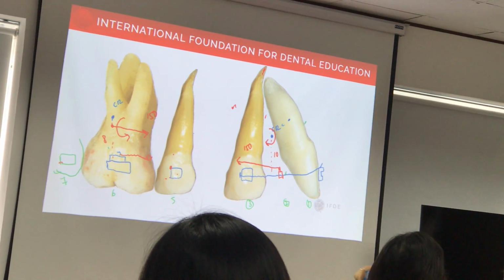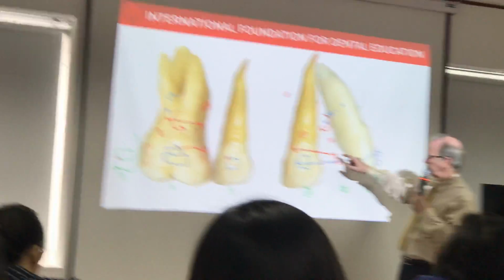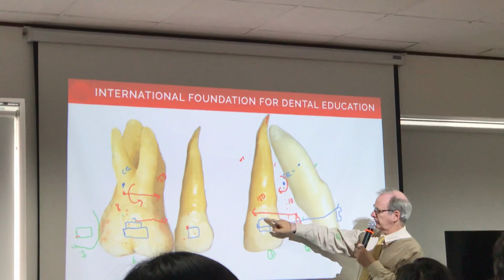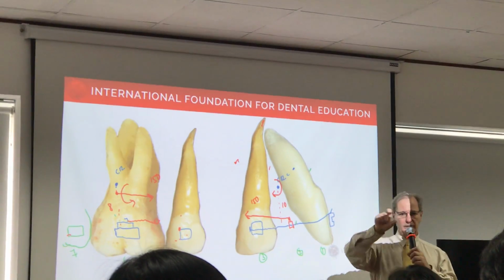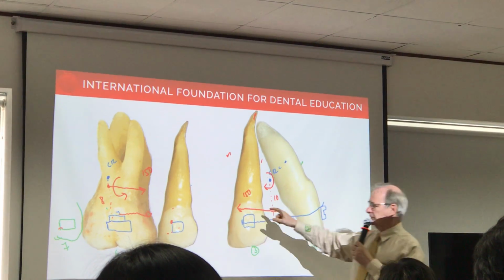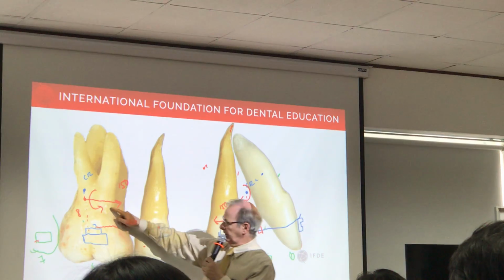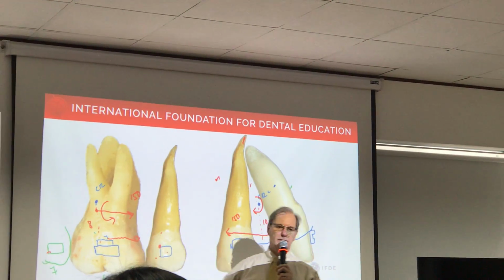Okay, everybody gets that? Okay. Yes. So the problem I'm having now, this force is good. Now, because of a straight wire, the counter moment comes from the big wire doing the couples on the brackets. The same thing here with the curve of Spee and the big moments. I'm getting this moment here, which is fine, but I still am stuck with this force.